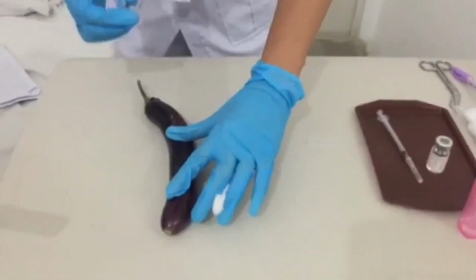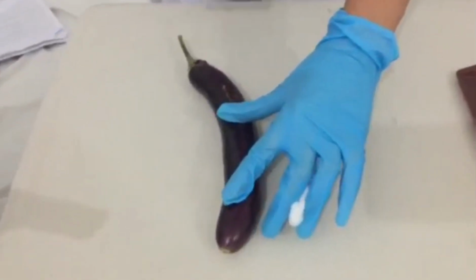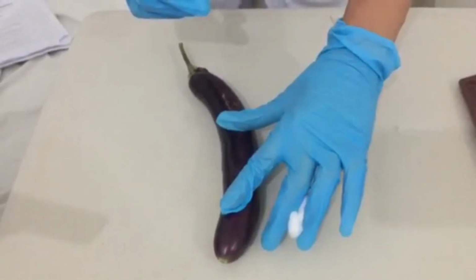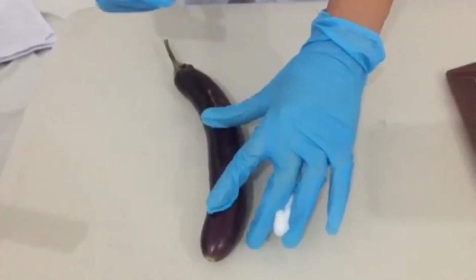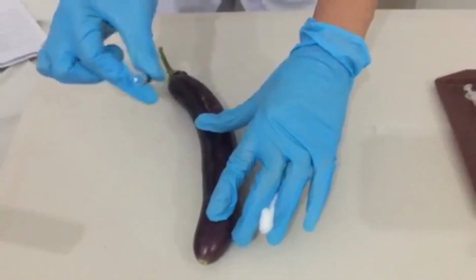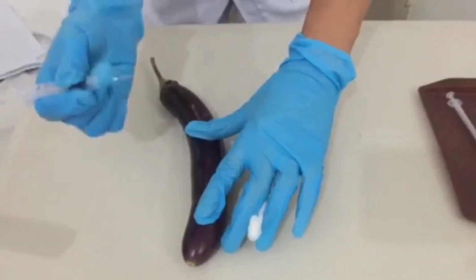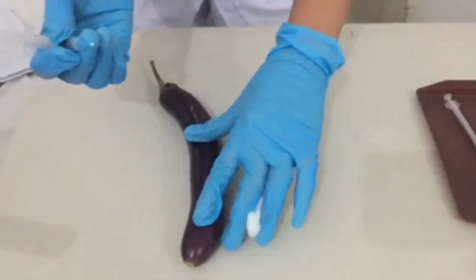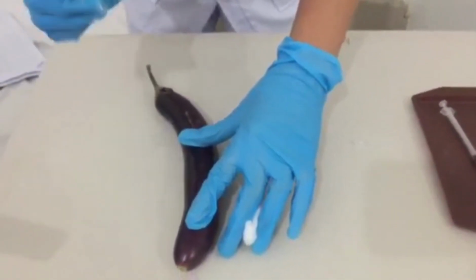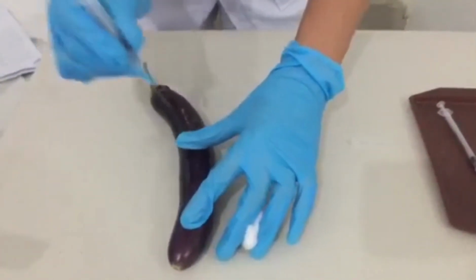So now use the ulnar side of the non-dominant hand to pull the skin approximately 2 to 5 cm or 1 inch to the side. Under some circumstances, such as for an emaciated client or an infant, the muscle may be pinched. I will now hold the syringe between the thumb and forefinger as if holding a pen, piercing the skin quickly and smoothly at a 90 degree angle, and then hold the barrel of the syringe steady with your non-dominant hand, and then aspirate by pulling back on the plunger with your dominant hand, aspirating for 10 seconds.